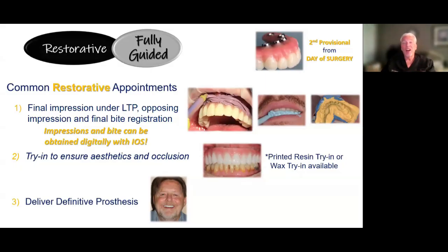So before you go to a final, always make sure you get a fresh impression, be it a scan or a physical impression of the opposing. I really recommend try-ins, even though you could say, well, the patient was happy, let's just go to a final. It's your call, doctor. Of course, you're in control of that. But I got to tell you, sometimes it's really interesting when we do a try-in, and we can do either a printed resin try-in or a wax try-in.